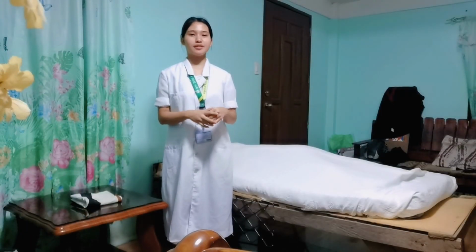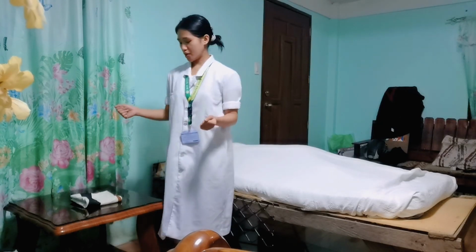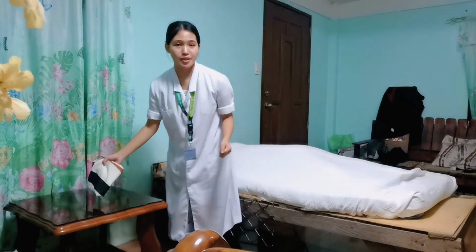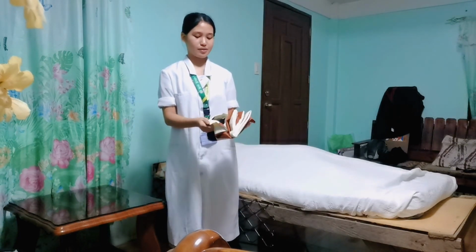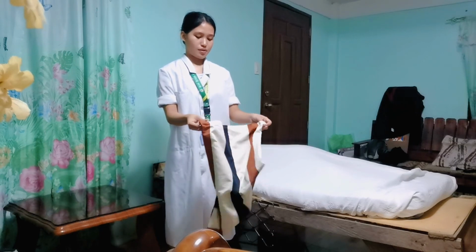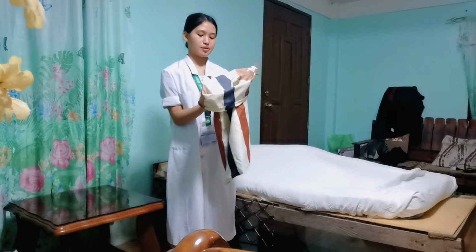Now that we are done performing hand hygiene and disposing the soiled gloves, we are now ready to change the pillowcase of the pillow. So this time, it's okay not to use the gloves. So again, you will be folding the pillowcase into half.